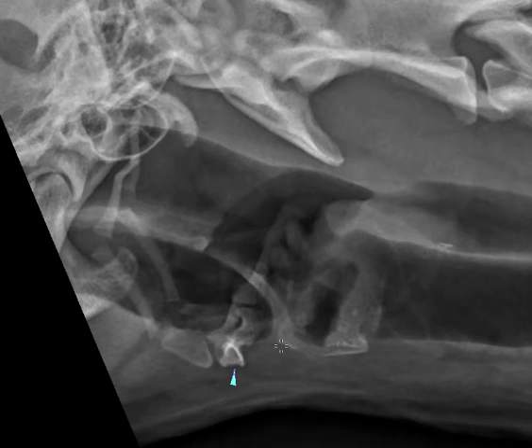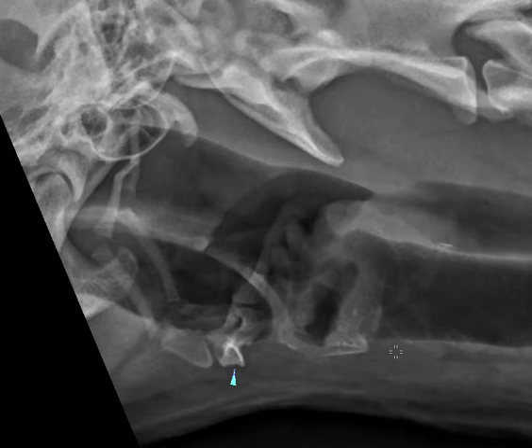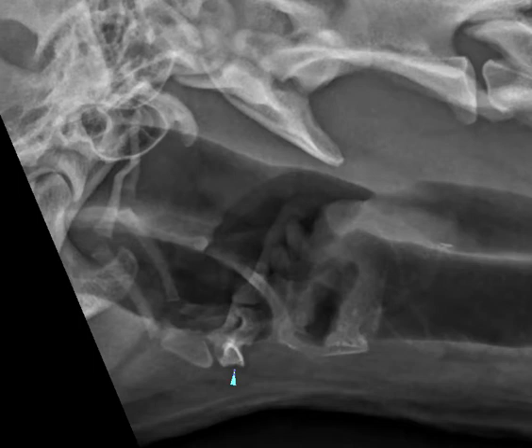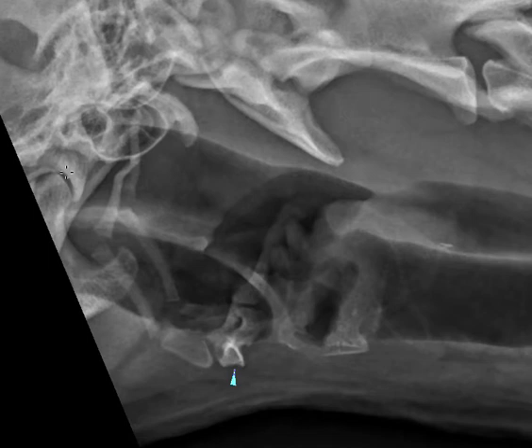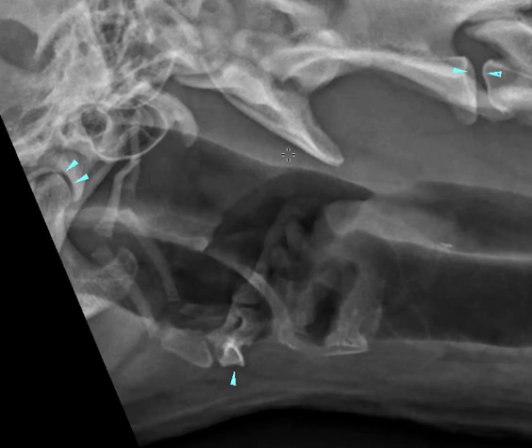The larynx is this whole region here, and there's quite a lot to be seen. You'll recall that the larynx is composed of multiple cartilages, as well as laryngeal ventricles and the lumen and the mucosa. For the laryngeal cartilages, they're going to give us an additional challenge every time. You'll recall that cartilage is of soft tissue opacity - we've seen this throughout our musculoskeletal series. So if the larynx is made of cartilage, it's also going to have a soft tissue opacity, which is going to make it hard for us to see it on radiographs, because it will silhouette with adjacent structures.